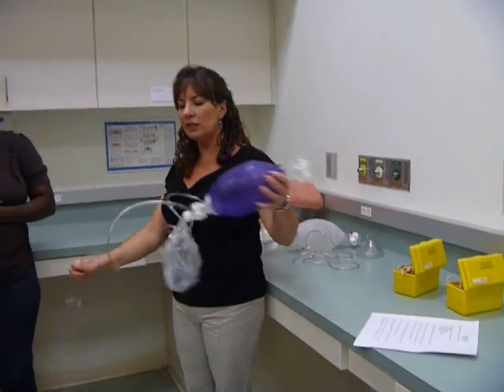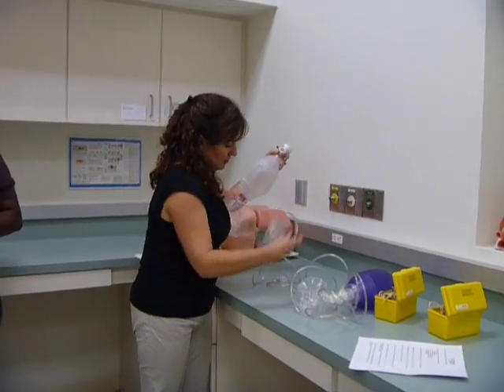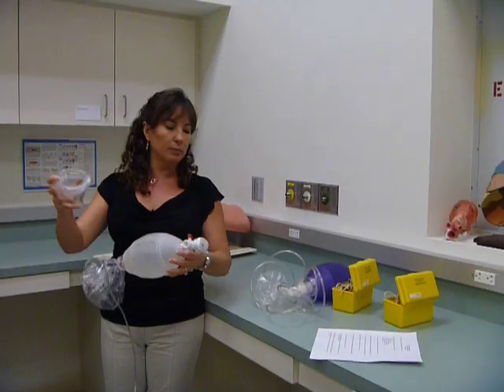So this is the Ambu bag or the resuscitator bag. They're both called Ambu bags or resuscitator bags.